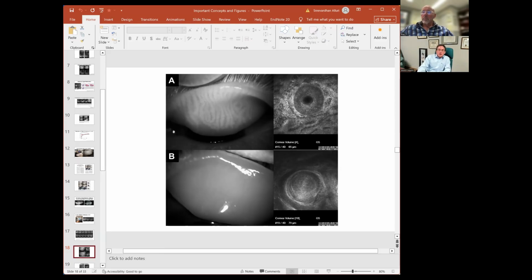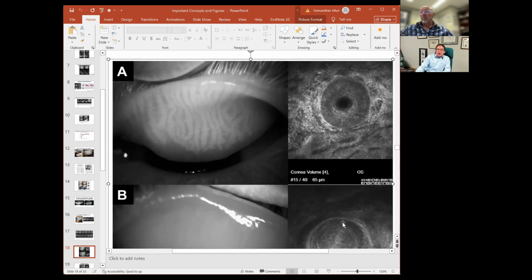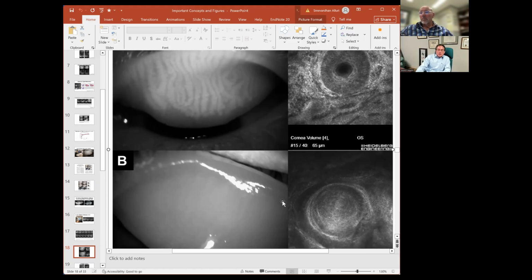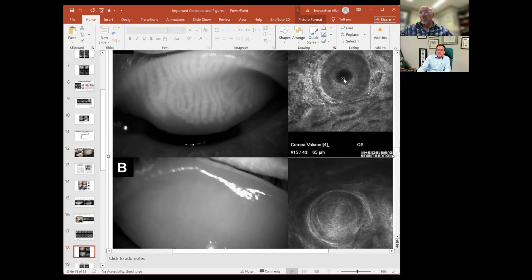there's a meibography above, which shows, for the most part, healthy meibomian glands, and that correlates with the ridges seen in A. If we zoom in, we can show that a little better. There are ridges there, and there's a well demarcated basement membrane and basal epithelium, very well visualized. I should say there's also a well-established lumen in A as well.